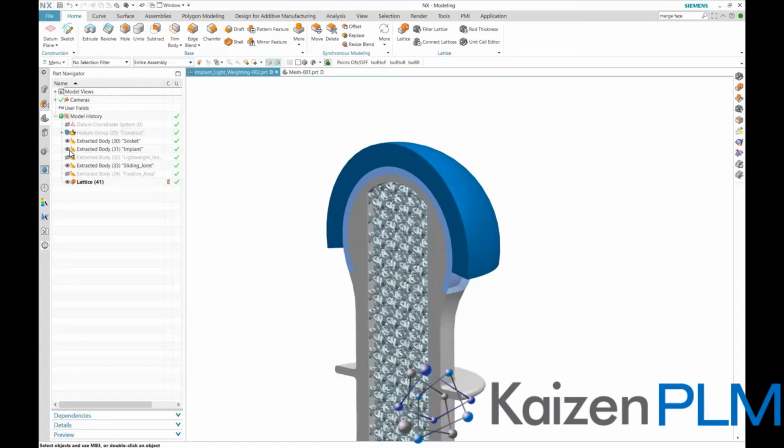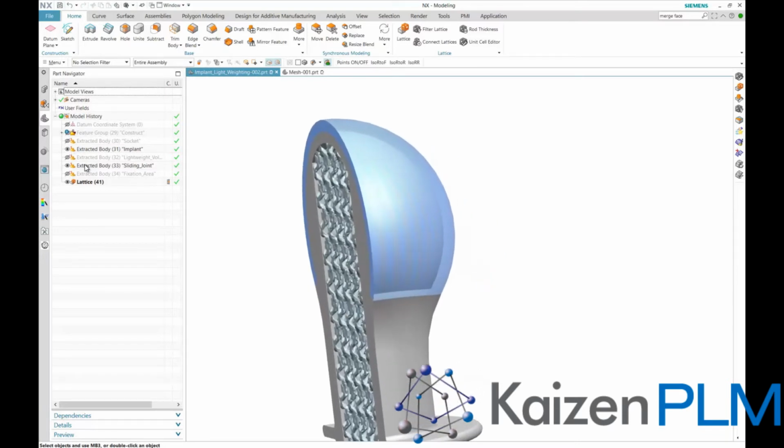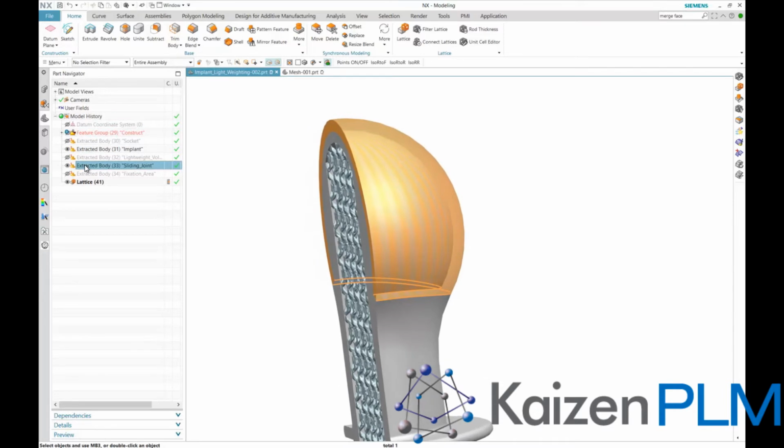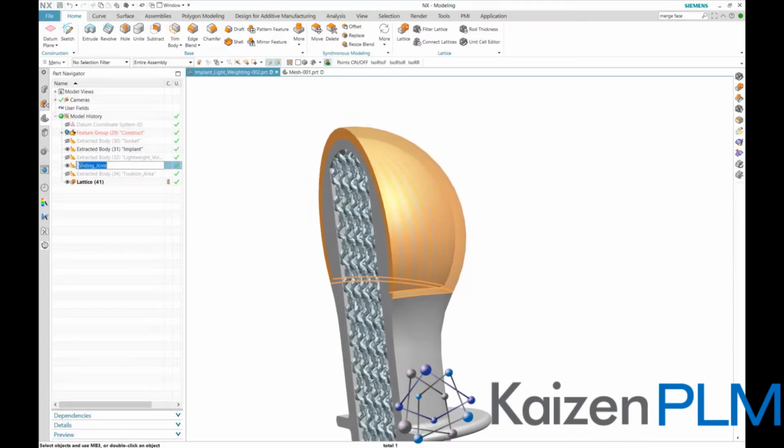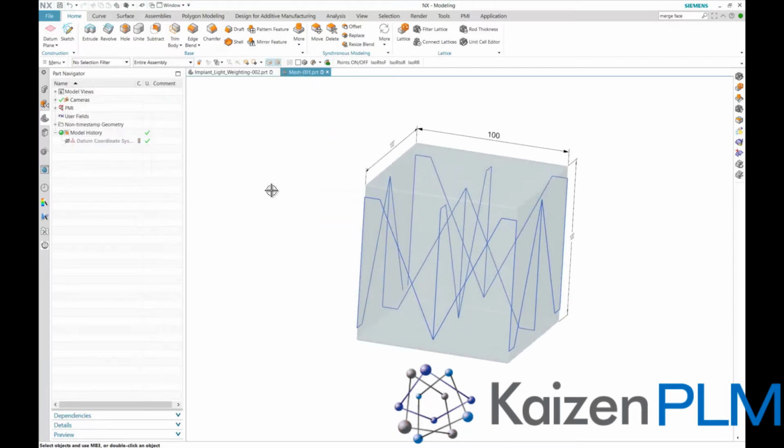We will now continue by adding the fixating mesh to the implant's ball joint. To make it clear, we hide the socket attaching to the hip. The intention here is to add a mesh to the ball of the implant, as this will help fixate the polymeric layer of the ball. As the mesh we require does not exist, we need to create it.